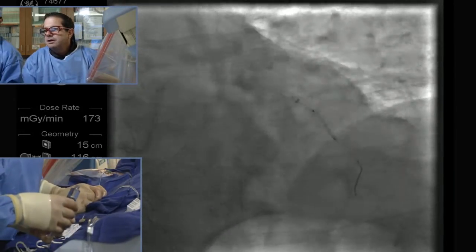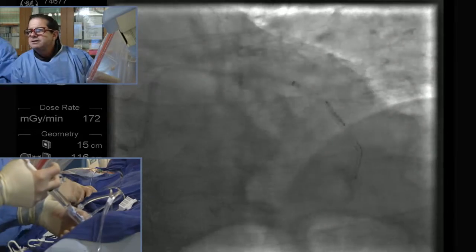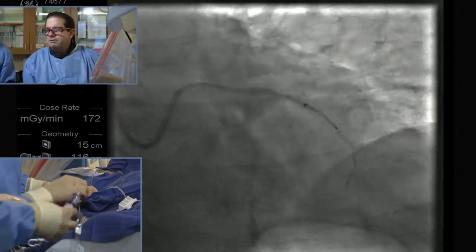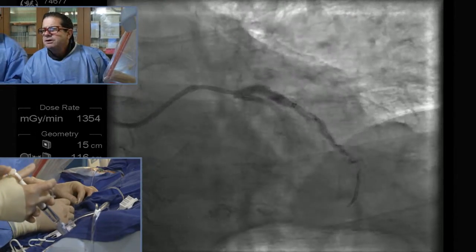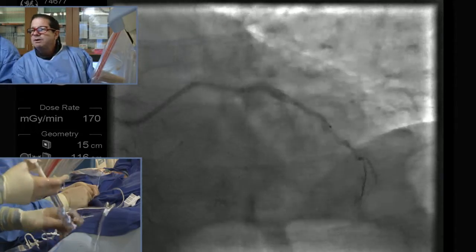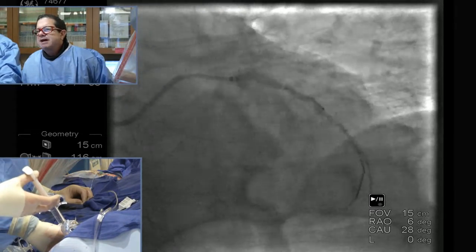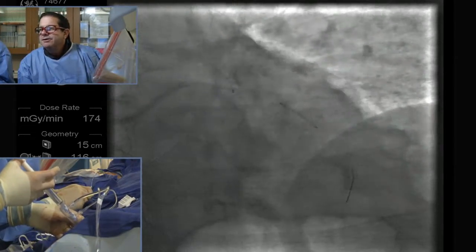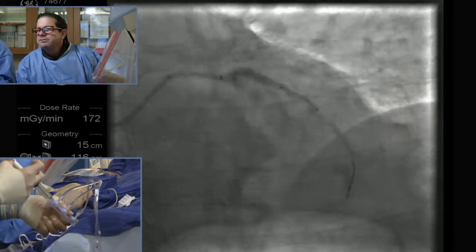Let's test there and see. We definitely got it. Right about there is where I'm going to go. I'm going to do an easy test — you're in the guideliner so I can come back a little bit. Test there to see where we are. I'll save some radiation and dye. Maybe back a tiny bit. Test again. Should have been a longer stent, maybe. Take it up: 10, 12, 14, 18, 20, 22. Down. Stent to play.